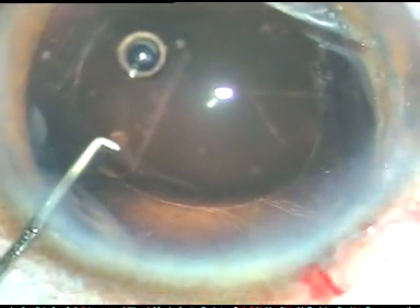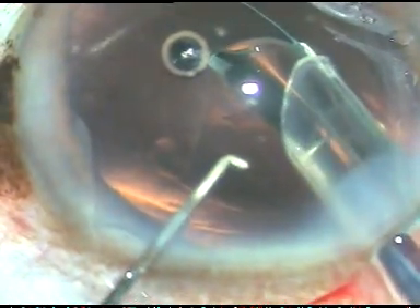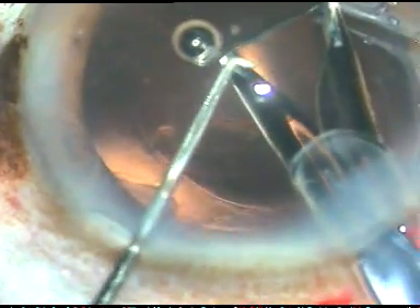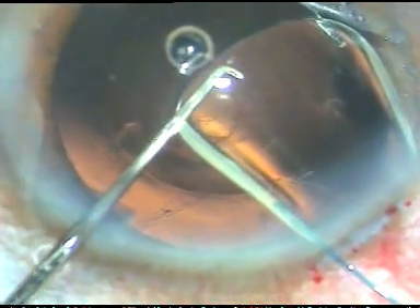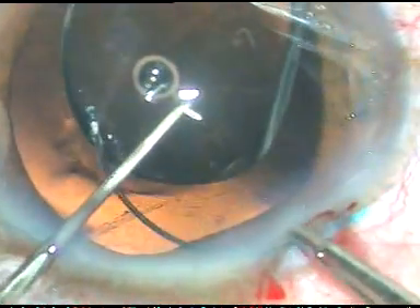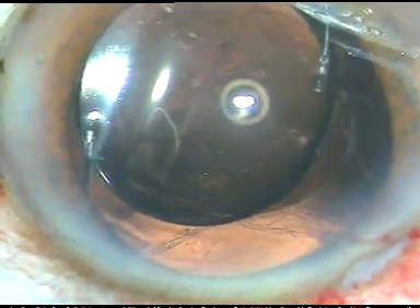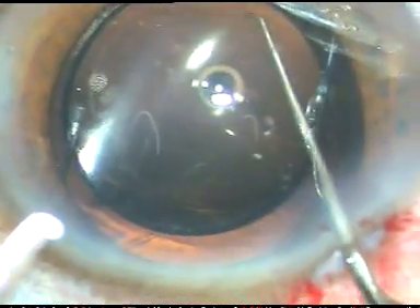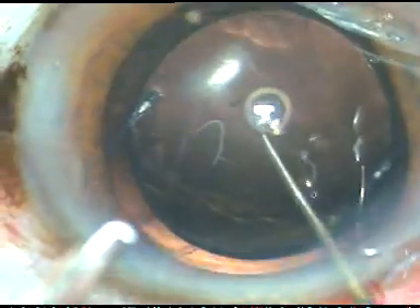Now here it is — go, rotate the cartridge clockwise. And I see that the leading haptic is going into the sulcus. As it goes, I rotate the cartridge anticlockwise. The lens is supported by the chopper. I take a McPherson's forceps and I place the trailing haptic in the sulcus. So both the haptics are in the sulcus at this moment. The anterior vitreous face is intact. And the lens is nicely placed.